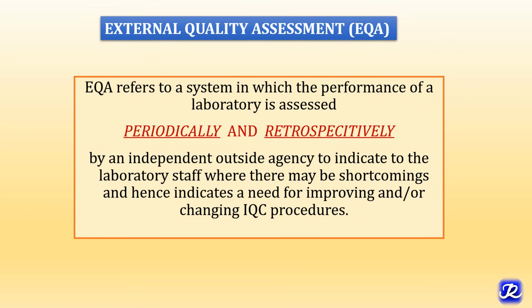It is done by an independent outside agency, for example BioRad, RIQAS or CMC Vellore, to indicate to the laboratory staff whether there may be shortcomings and hence a need for improving or changing IQC procedures. So by the EQA report, we come to know whether our results were accurate or not, and depending upon the results we can change our IQC strategies.